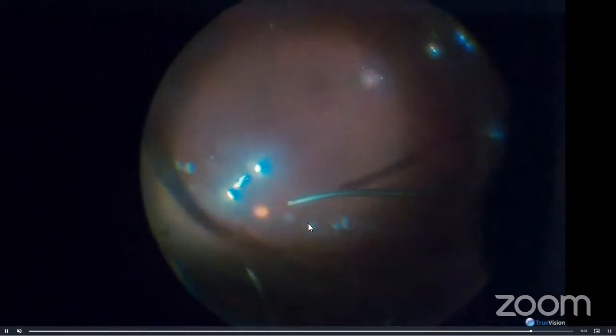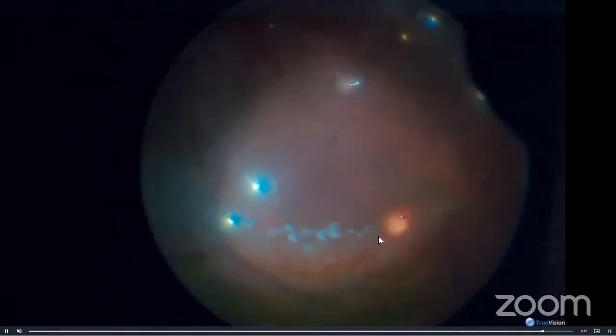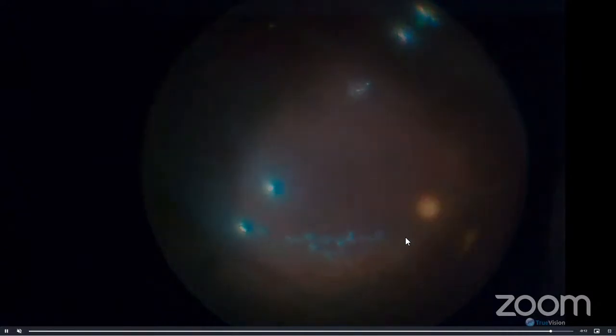Usually you can do 3 to 4 rows of white confluent laser marks to barricade around the area. The most important thing is to go 360 degrees, covering up to the horn, which is the end of the apex of your giant retinal tear.